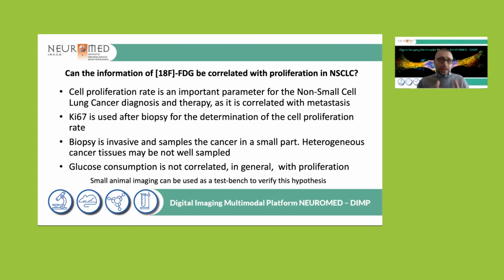So in this case, FDG is the tracer for glucose consumption, and glucose consumption is not in general correlated with proliferation. Small animal imaging can be used in this case as a test bench to verify this hypothesis. Let's see how.